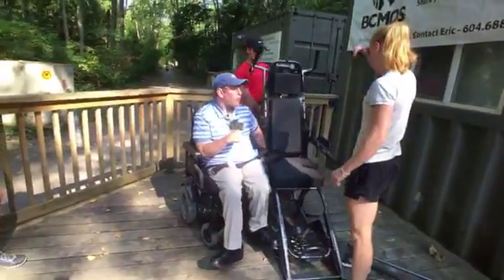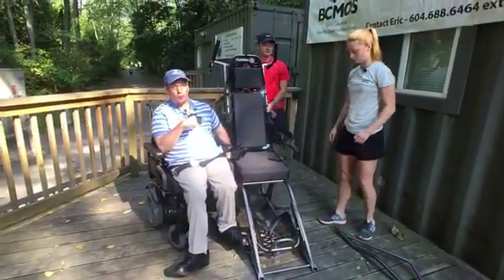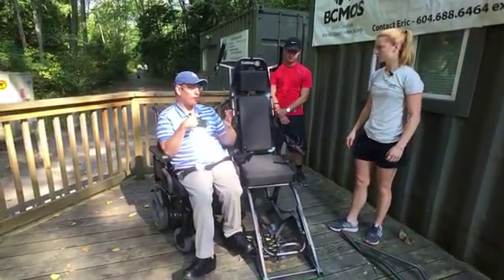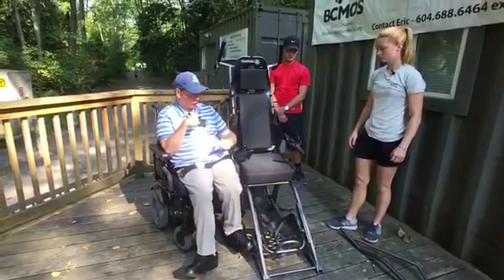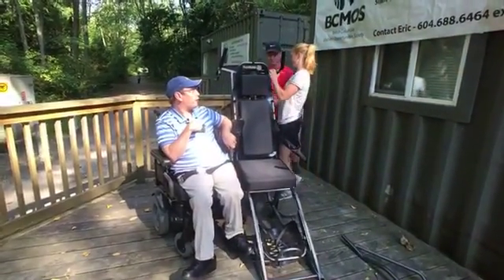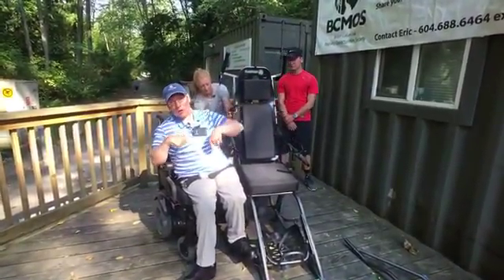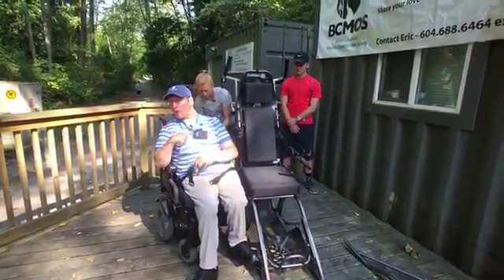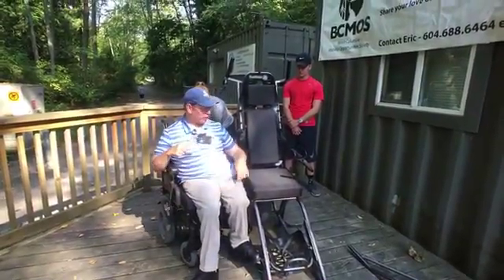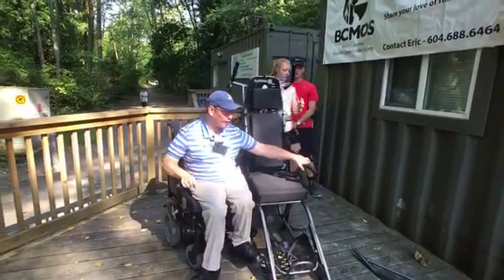Okay, and then as far as a wheelchair goes, when you're transferring, obviously you're going to know it the best. Mm-hmm. So for me, it's safety practices like any other transfer. I have the power turned off. I'm just going to swing this armrest back. I'll get you to kind of help me take this back a little bit, Alex. Obviously, I got the brakes on. You want to make sure the seatbelt's removed. And then I'm going to scoot over. I'll get Alex to help turn my legs as needed.